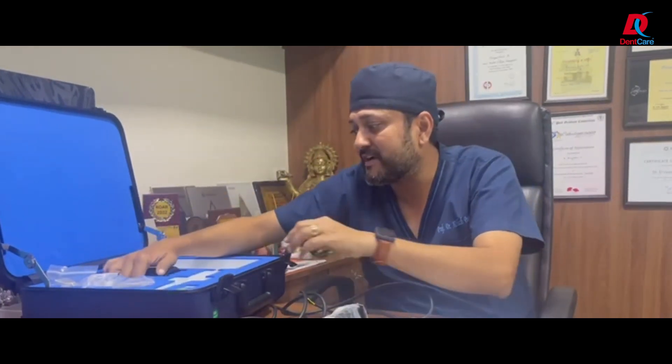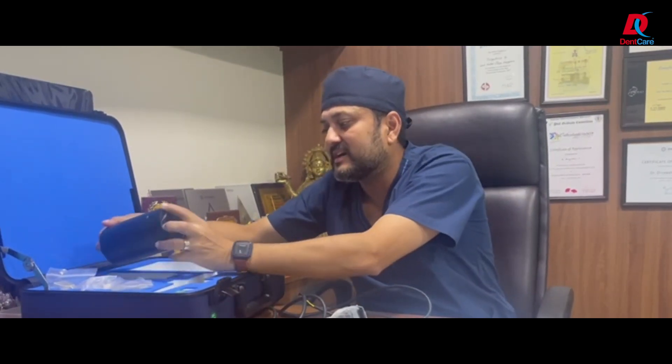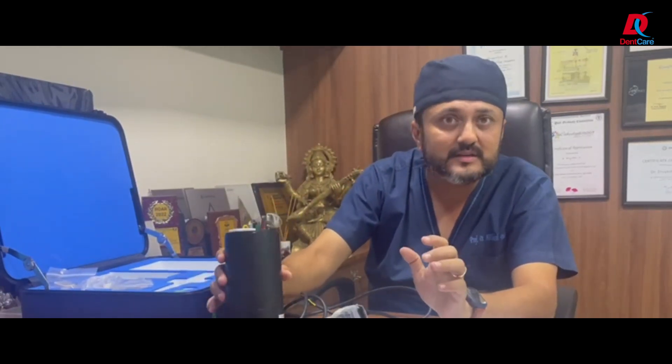The best part is you also have a calibration machine, which helps in calibrating things and getting accuracy in your scans.